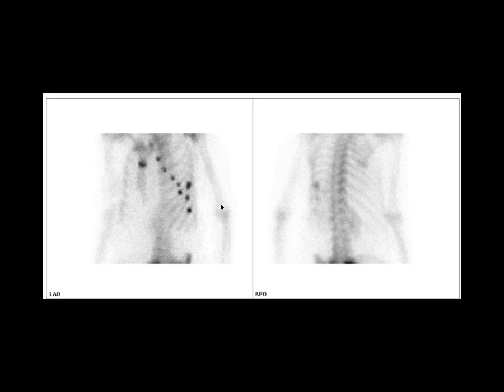Here's a patient who had a seatbelt injury in a road traffic accident. There's a transverse band of activity from a sternal fracture, and multiple foci of increased activity all in line. The history will be very suggestive, but it would be most unusual for metastases to have this distribution. Don't forget — a patient may undergo a bone scan for query metastases many months or a year or two after fractures, and may not give a good history, so we must be alert to occult fracture activity.